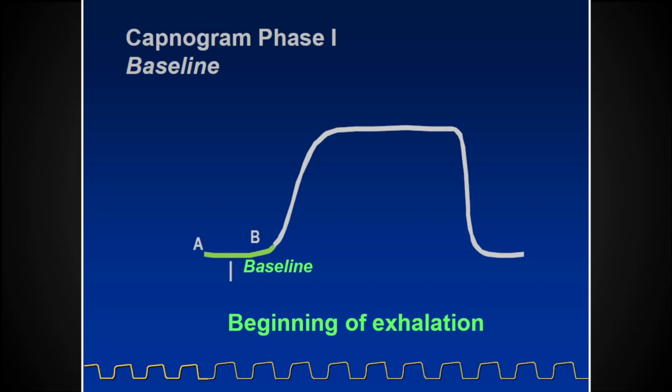In healthy patients, is it going to be very consistent like that, or is there a lot? Yeah. No, I mean, there is variance, but unlike an EKG, there's far less variance than an EKG. The more rectangular looking, essentially the better it is. This is perfect. Your expiratory phase is about twice as long as your inspiratory phase. Sorry, reversed, essentially. I don't want to go too far on that.